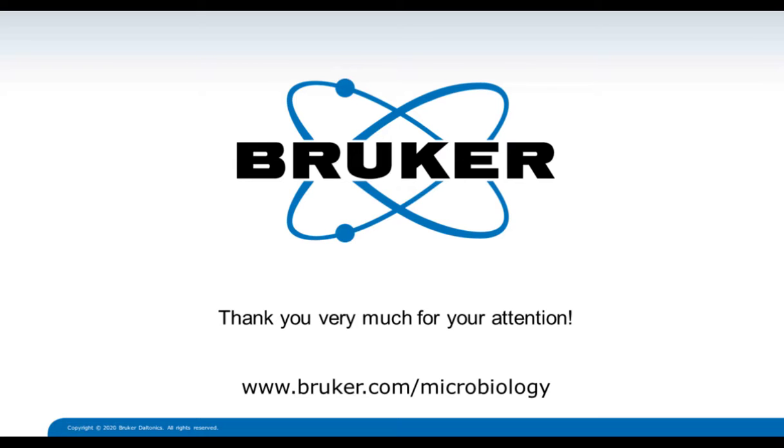Okay, indeed a complex question. There are a couple of parts to it. Yes, and I will try to explain that in detail. It is an amplification kit, a PCR kit, which is validated indeed with a GeneXtract NA kit. In addition, we do bridging studies also to other extraction methods. So it's not only restricted to the cartridges for the NA kit, but it's validated based on that.